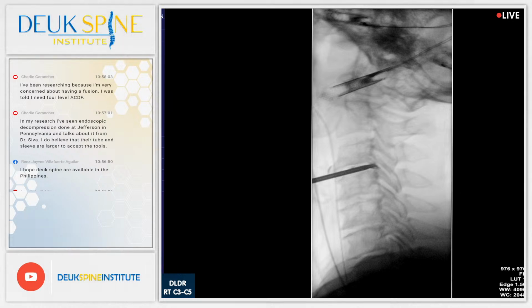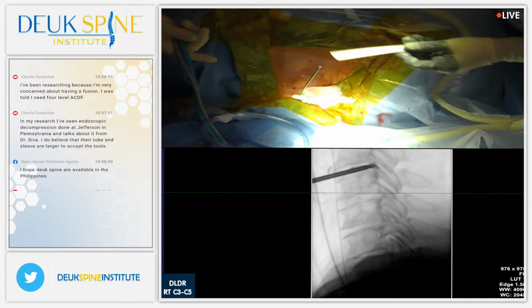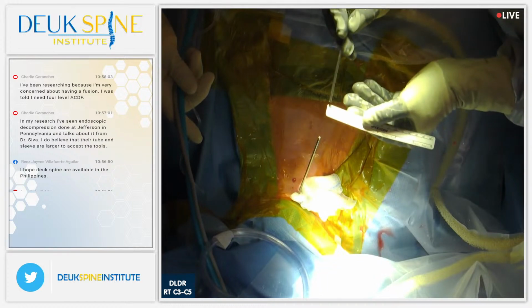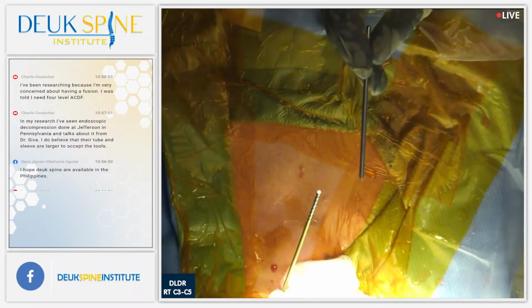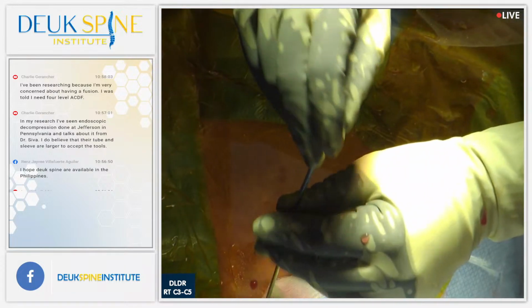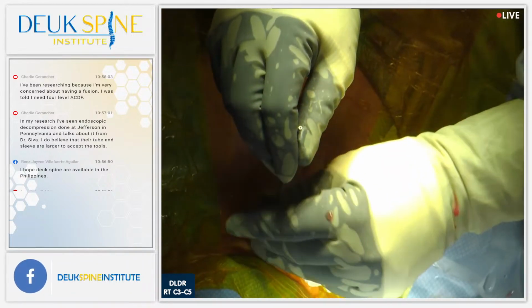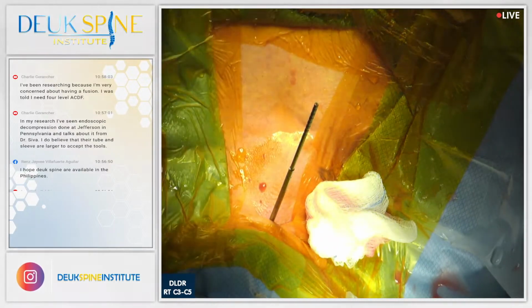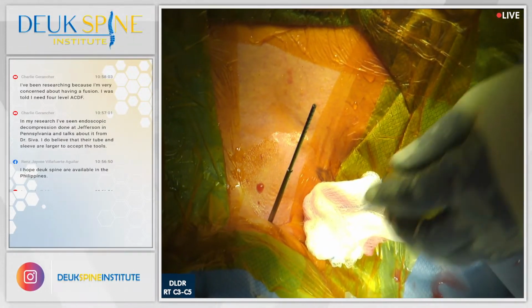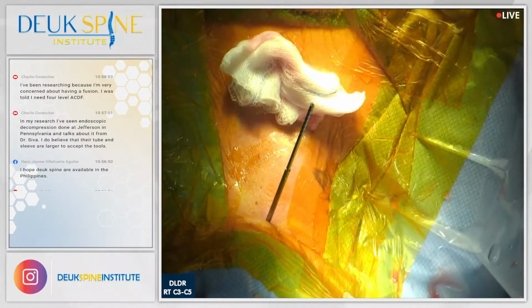By the way, for those of you who have never seen it, the entire surgery is done through this tiny little tube. Here are your metrics. It's 4 millimeters. Not even a half a centimeter. 4 millimeters wide, external diameter. And this is from Germany, Richard Wolf. They don't make it anymore. They want you to buy bigger ones.